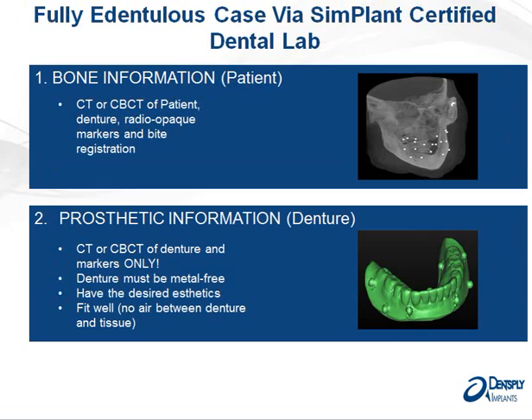Now finally, let's move on to the fully edentulous case. Basically here, all we need is DICOM information, meaning that we need cone beam information in the form of the protocol called the dual scan. And so we'll have a little video that's coming up just very shortly on the exact process of the dual scan and some tips and tricks to prevent some common pitfalls.